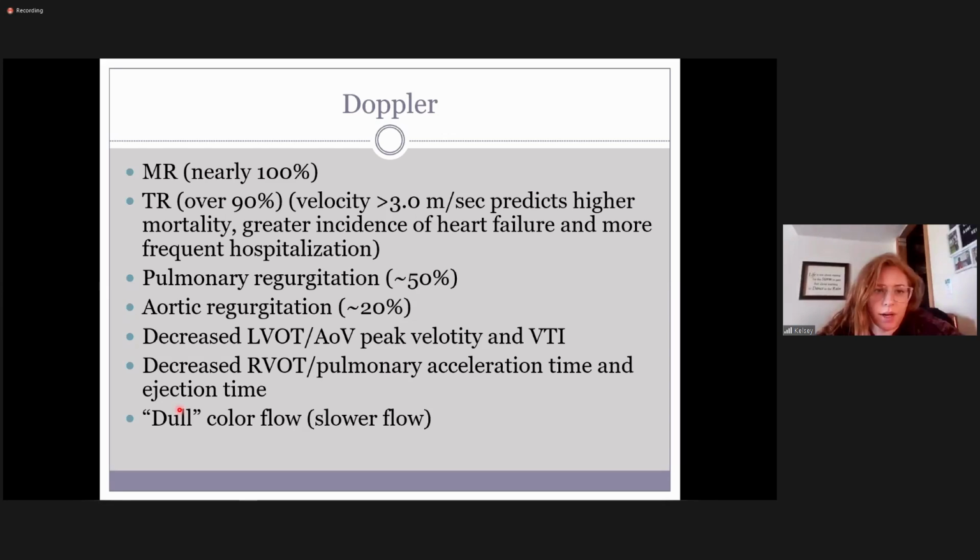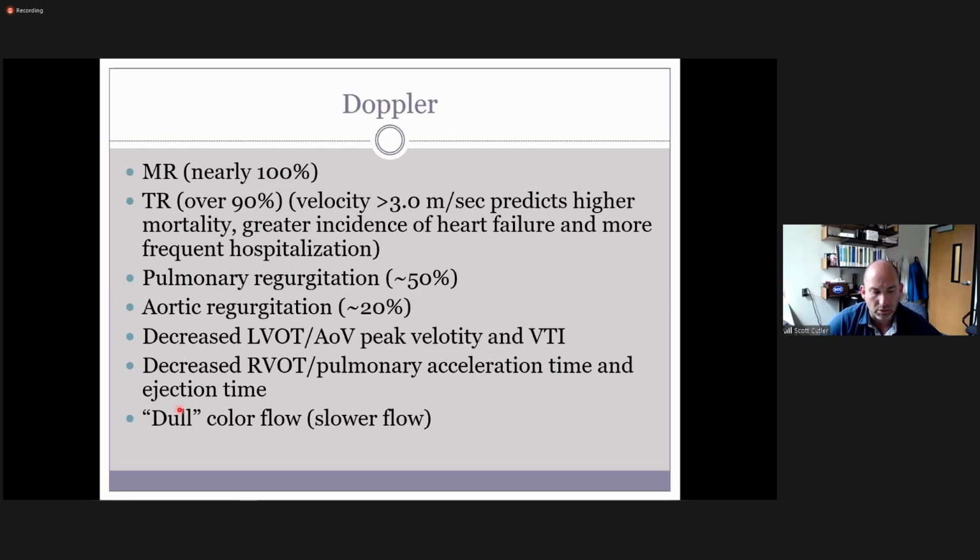In each lab, they'll have their formulated protocol for COVID patients too. Also, you've got full on PPE. Yeah, I think the scare is certainly less now, so you might not see this. So in most cases, you are going to do a full protocol.